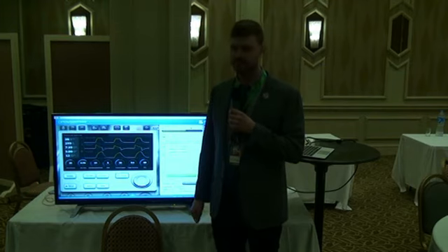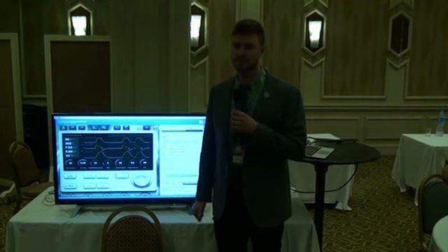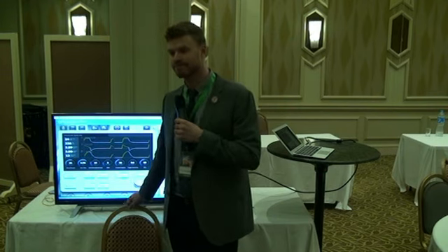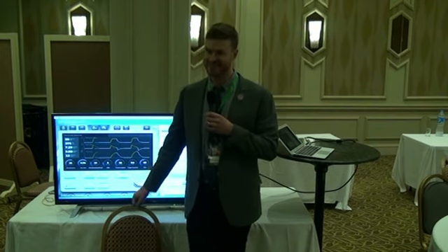Mm-hmm. So Professor Shaman, 20 years ago, when he was in France or something like that, he witnessed a burn from transcutaneous. So he said no transcutaneous. Yeah, that's all it takes, right? Is one bad experience. Could you convince him with the opposite?